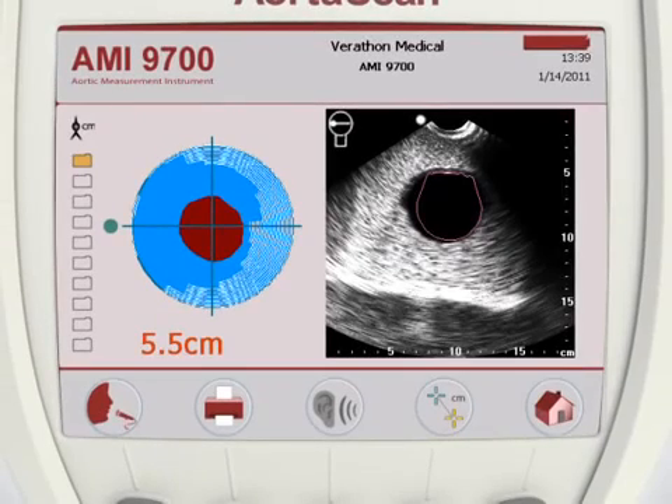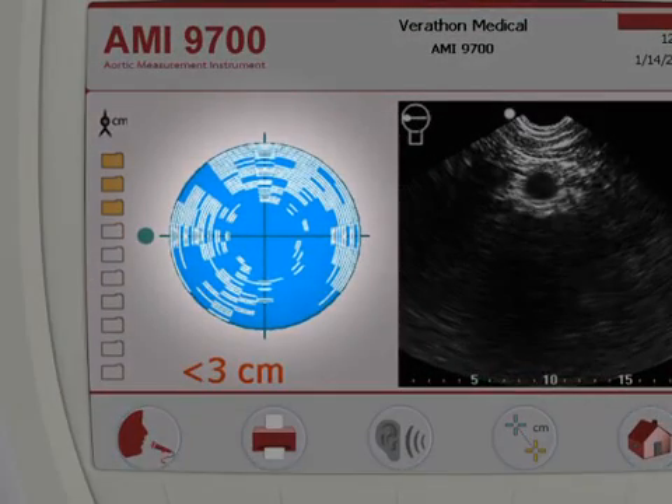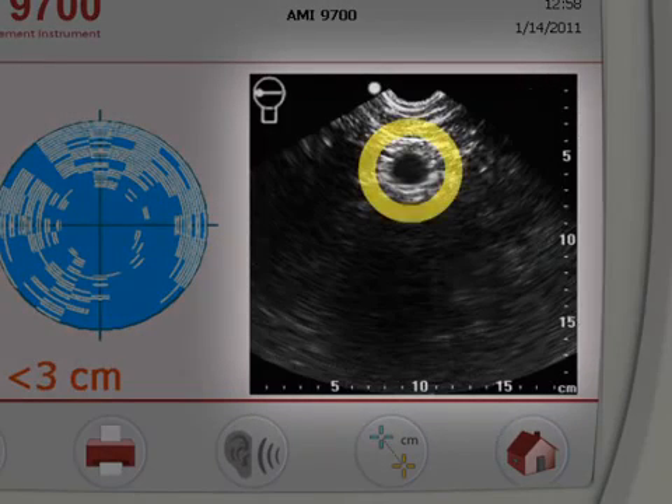A successful scan is achieved by positioning the probe so that the red aorta image on the aiming display does not intersect with bowel gas. The AortaScan AMI-9700 can detect an aorta with a diameter between 3 centimeters and 12.4 centimeters. For aortic diameters less than 3 centimeters, the aiming display will show no image of the aorta. On the results display, the round shadow at 6 centimeters depth is the patient's abdominal aorta. Note that an aorta with a diameter of less than 3 centimeters will show no red outline in the results display.